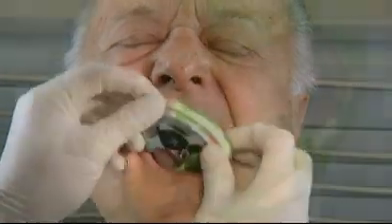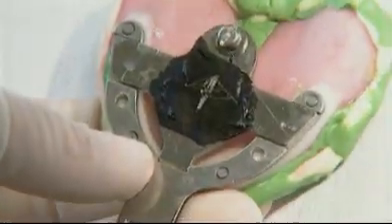Move the mandible to the right and back again. Remove the registration from the oral cavity and check it for accuracy.